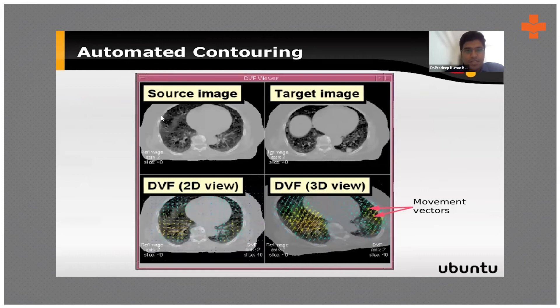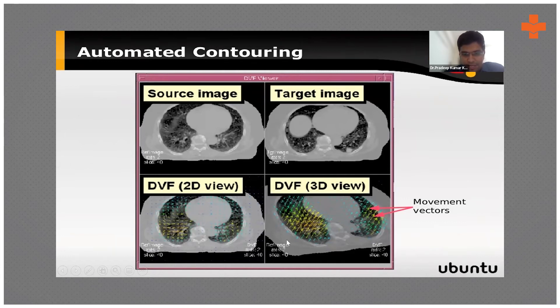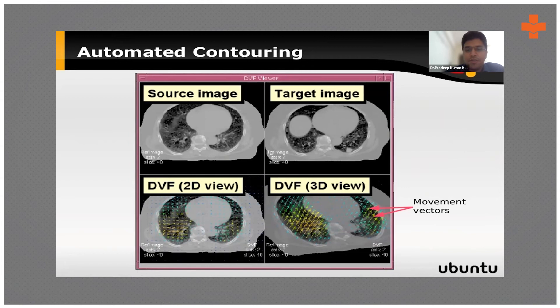In image-guided treatment, you have a source image — the original planned image — and a target image taken on the day of treatment, which may be slightly different. You view both in 2D and 3D and try to match them as precisely as possible to the source plan, so that the tumor will be exactly focused on during delivery.